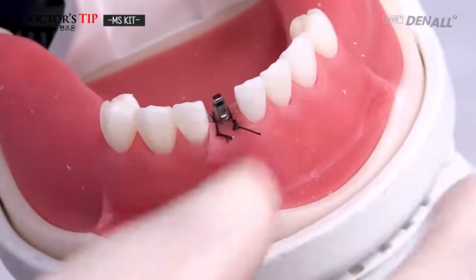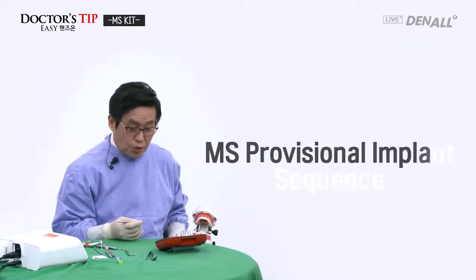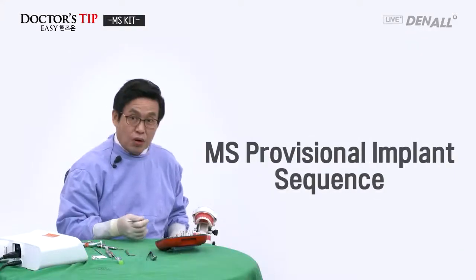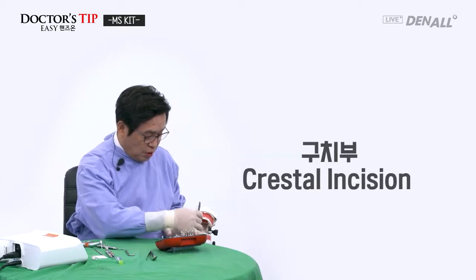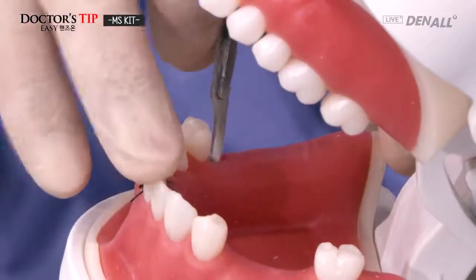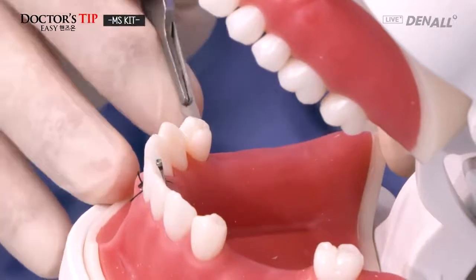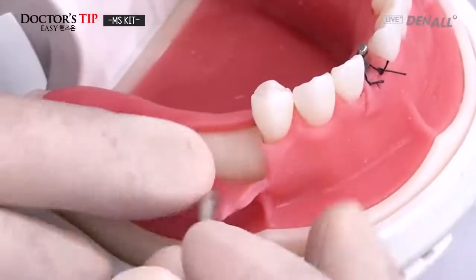Like this, an MS implant is placed, and now you can create a provisional restoration. Next, let's see the provisional implant sequence, and I'll show you how it can be bent. I'll place one in the molar area: crestal incision, and then the flap is elevated.